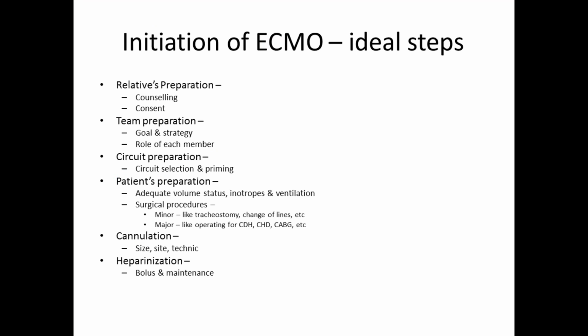So while initiating ECMO, the ideal steps are: first, you have to prepare the relatives, counsel them, and take consent from them. Second is team preparation. Third is circuit preparation. Fourth is patient preparation, then cannulation and heparinization. First step is relatives preparation, counseling and consent.